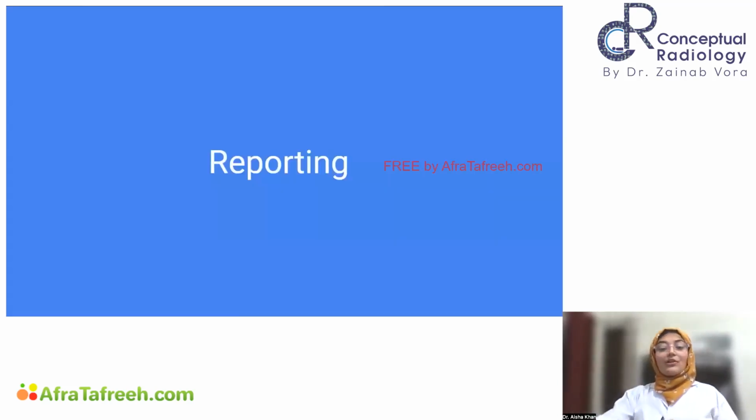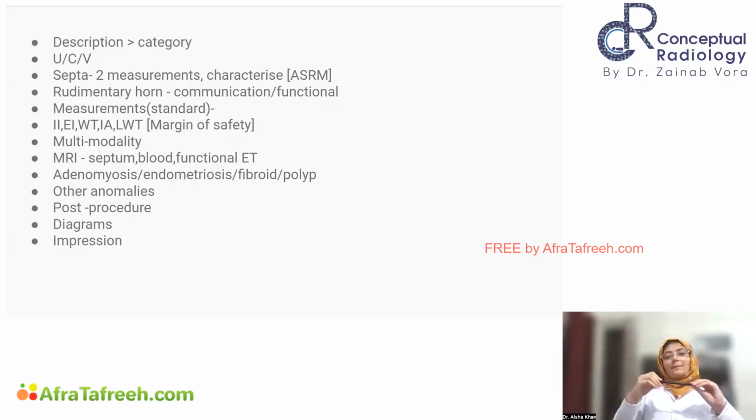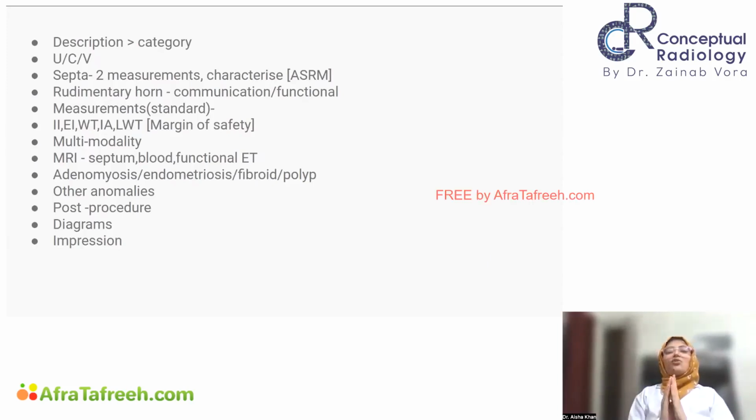Okay, now comes a really significant thing, that how do we do the reporting? Okay. So some important points to be kept in mind. Just give the description. It is not important to force fit it into one particular category. Just give your description very coherently. Second thing, look at the uterus, the cervix, as well as the vagina. All three things to be noted.